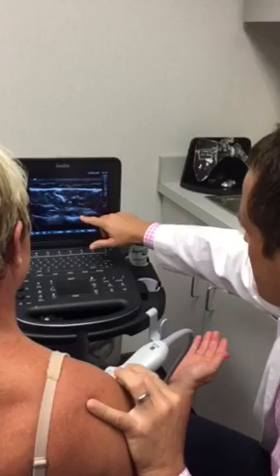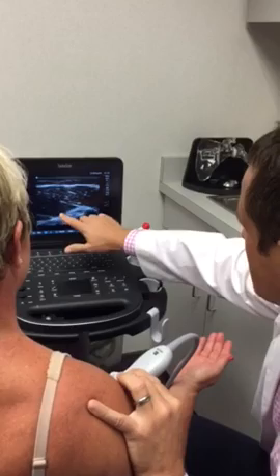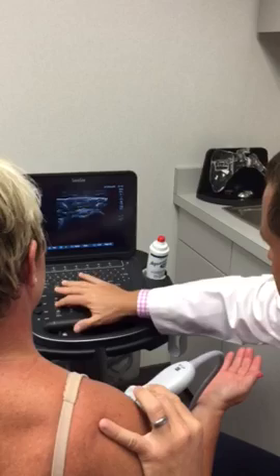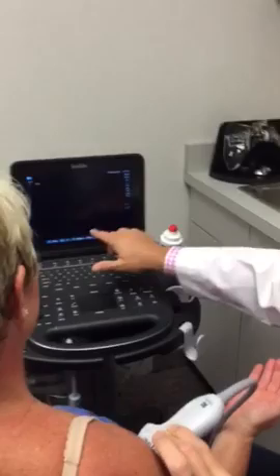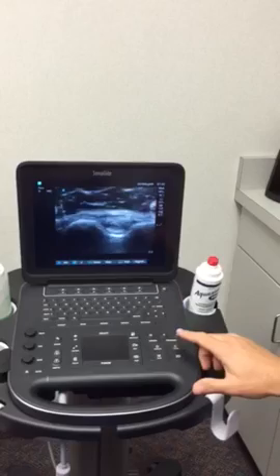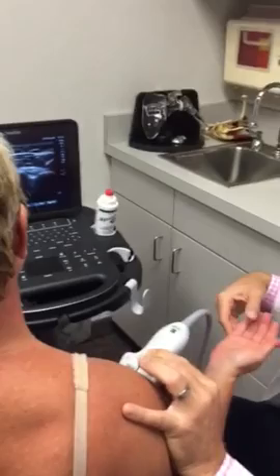As you probe down the biceps tendon, you can see Shanda has a little bit of fluid around her biceps. You're getting into the musculotendinous junction, and right here coming across is the pectoralis major tendon at the musculotendinous junction of the biceps. She has a small amount of fluid — maybe a little tendinosis; she works out pretty hard. And this right here is the transverse humeral ligament.